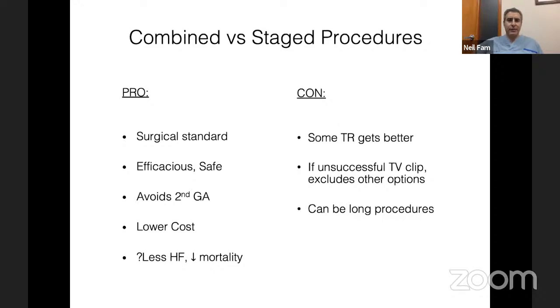In favor of staged procedures, sometimes the TR gets better after treating the mitral valve. If you have an unsuccessful tricuspid procedure with edge-to-edge, you may exclude other options, and these can sometimes be long procedures. And I suppose in the US, we also have to mention reimbursement.